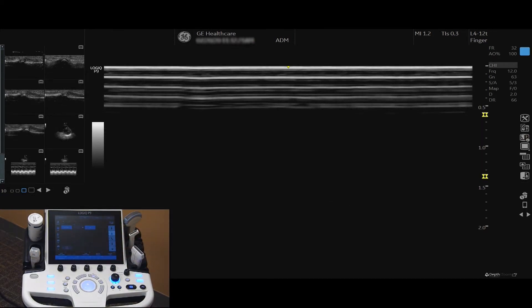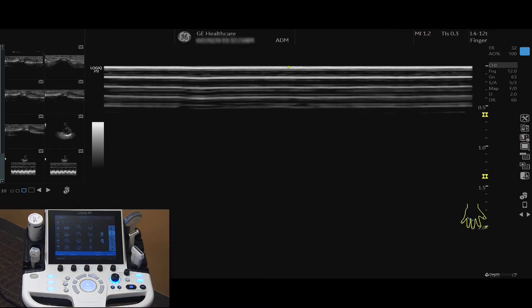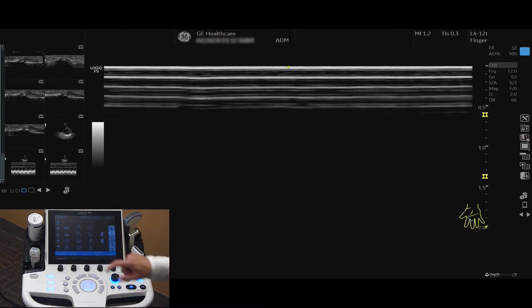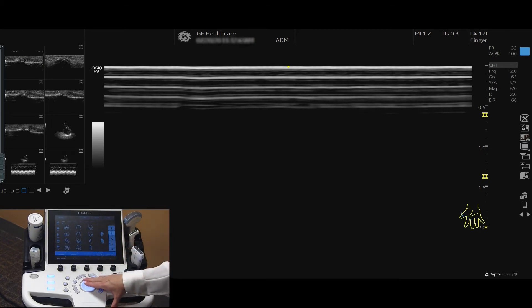Push the body pattern rotary button to add an icon to your image. Select the desired body pattern from your touch screen. A large image will appear with a symbol for the probe. Turn the rotate probe button to change the probe's position. Use the trackball to adjust the probe's location.